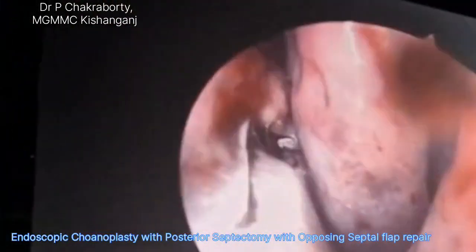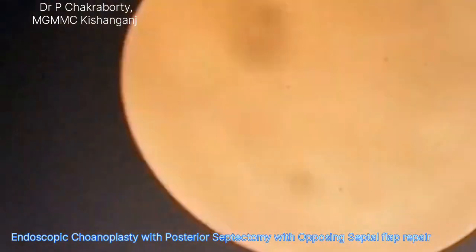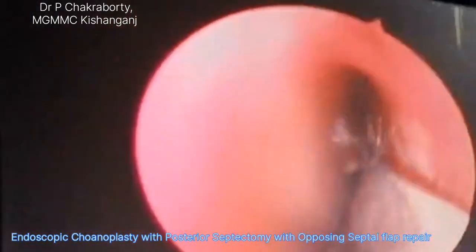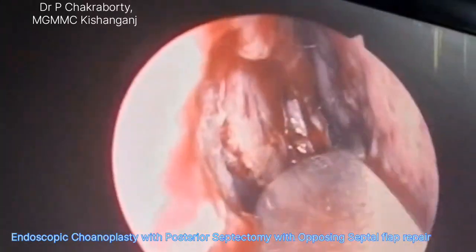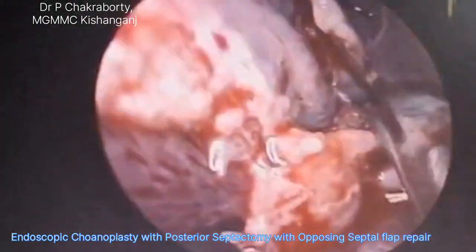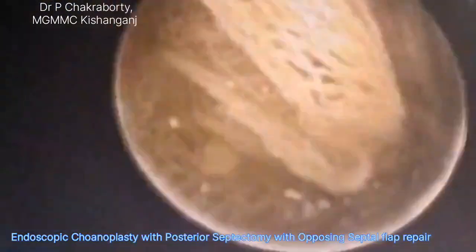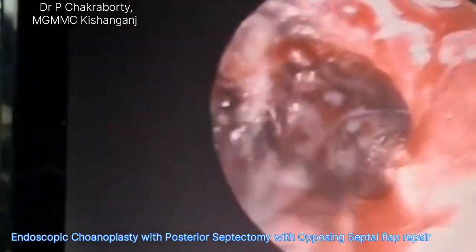So here we are using a scissors to cut the superior part of the posterior end of the septum. And mind it that we have preserved the mucoperiosteal flap on both sides, so that we can use it for covering the open raw area superiorly and inferiorly. So here the septum is being cut. Again, in the left side we are doing the same thing.